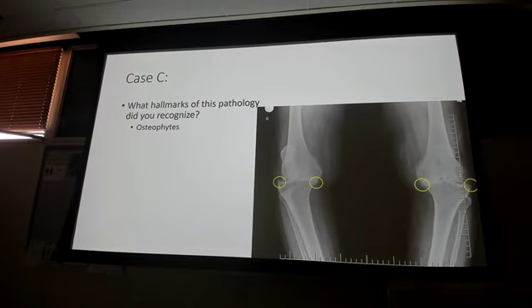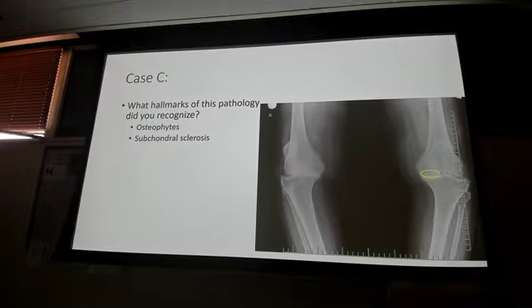Congratulations, right? Bone on bone. That's going to hurt for a while. This is why the injection stopped working. Okay.